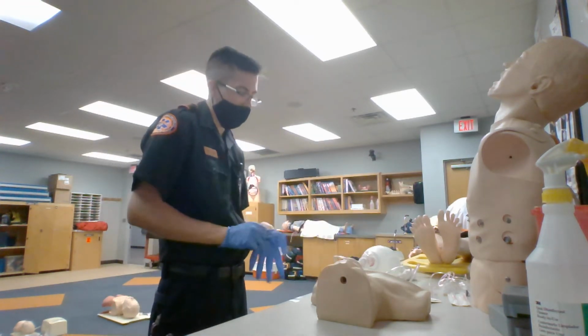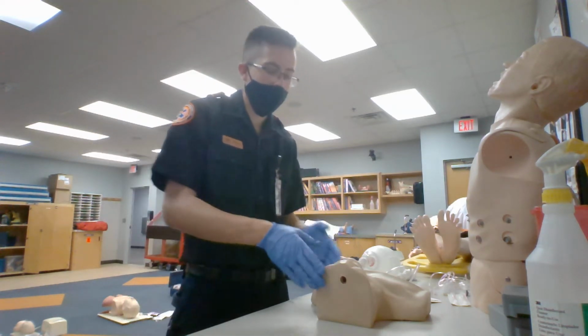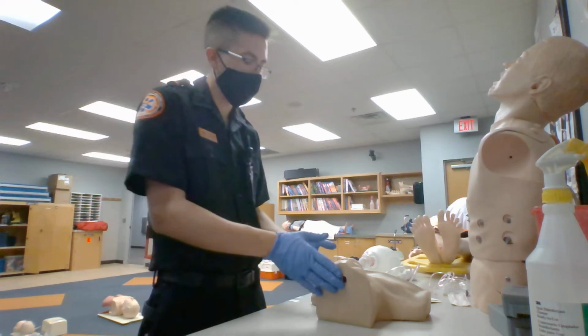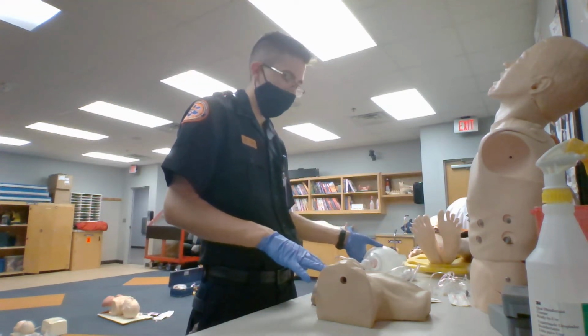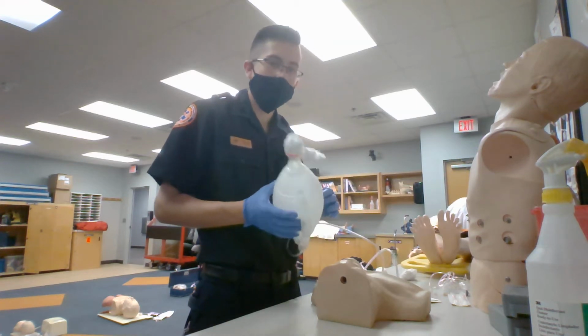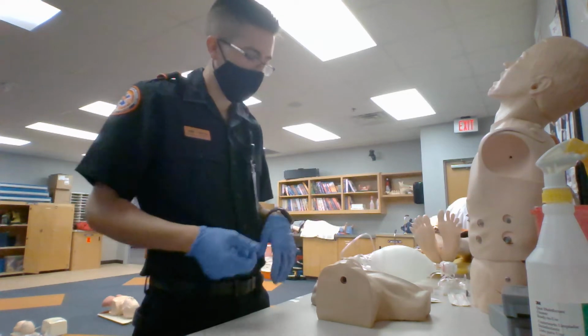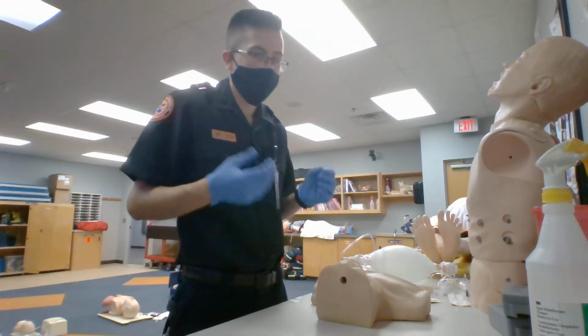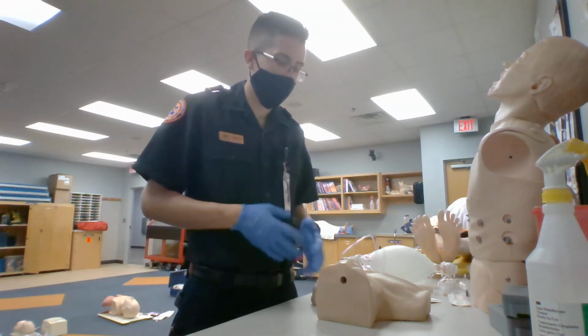Okay, so moving on from that, after I've gathered up all my materials, I am going to put on proper PPE. I'm going to come over to my patient, lay them supine, and then I'm going to hyperextend their neck. Once I have hyperextended their neck, I am going to ventilate them with BLS measures, just trying to see if there's any way I can still breathe for them. If I am unable to intubate, then I'm going to consider needle cricothyrotomy.